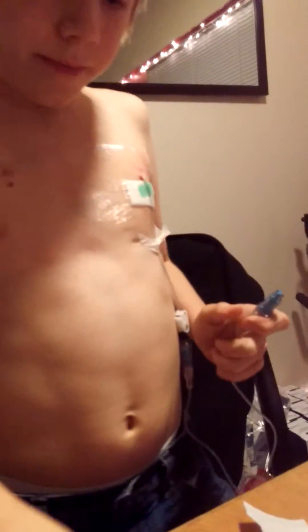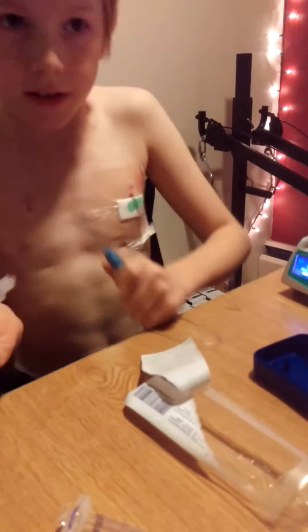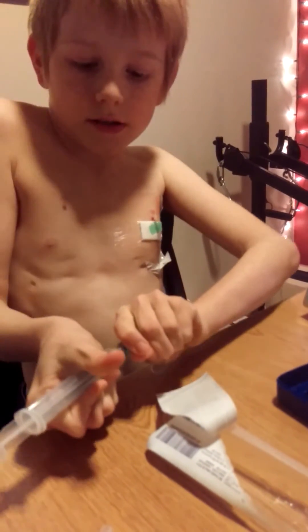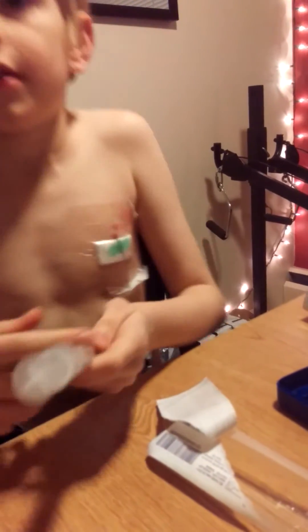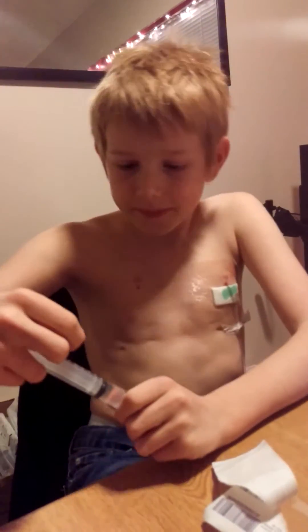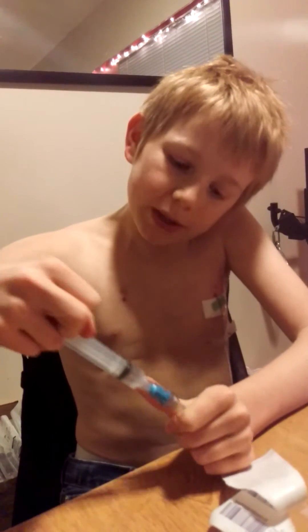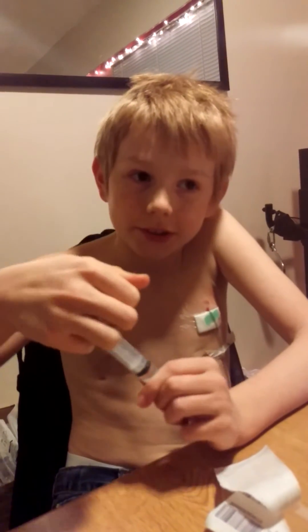Take our 10cc syringe and attach it here. We pay attention to what we're doing and not the TV, right? Now I've never pushed it in — it feels a bit weird having it pushed in, but not really all that much.